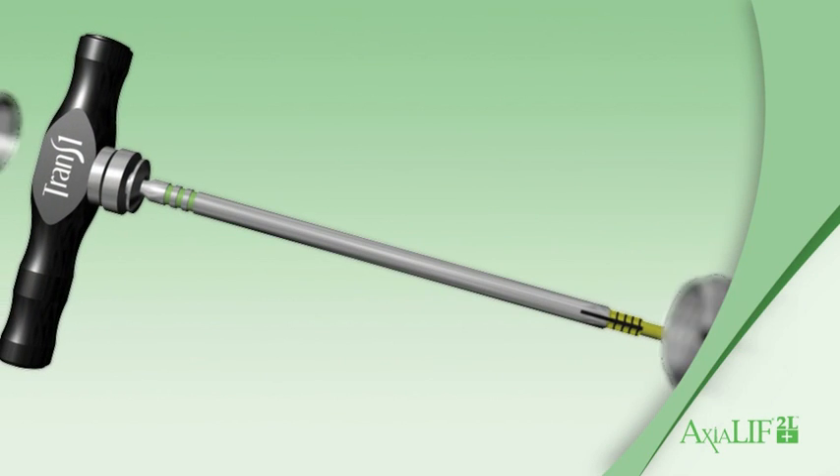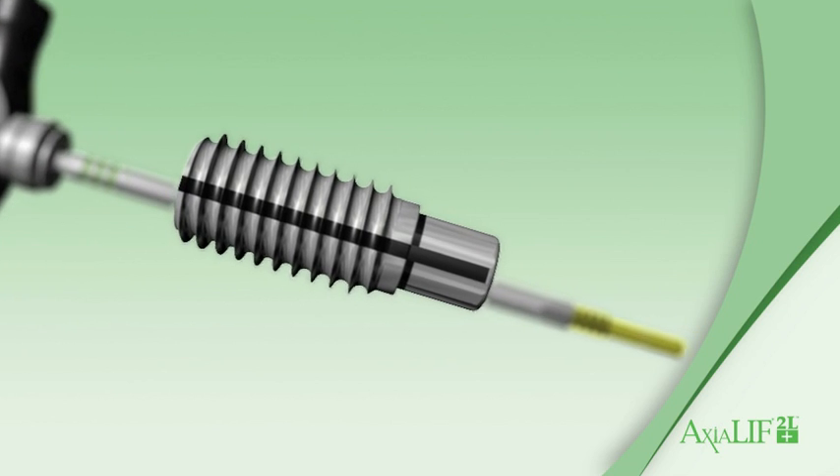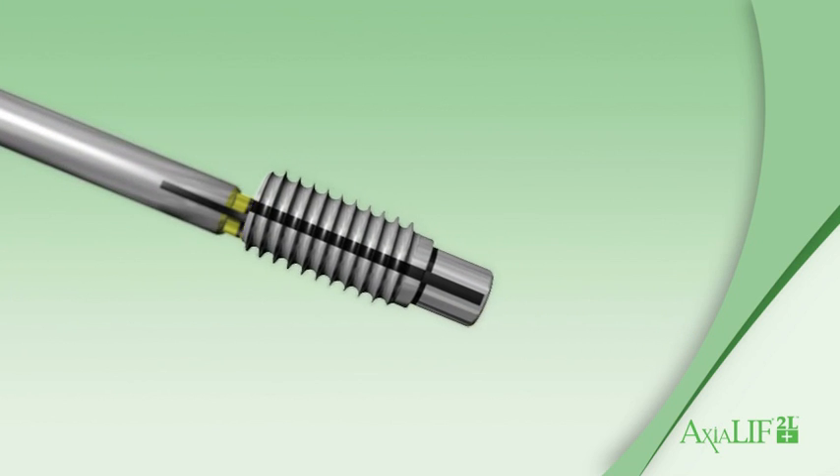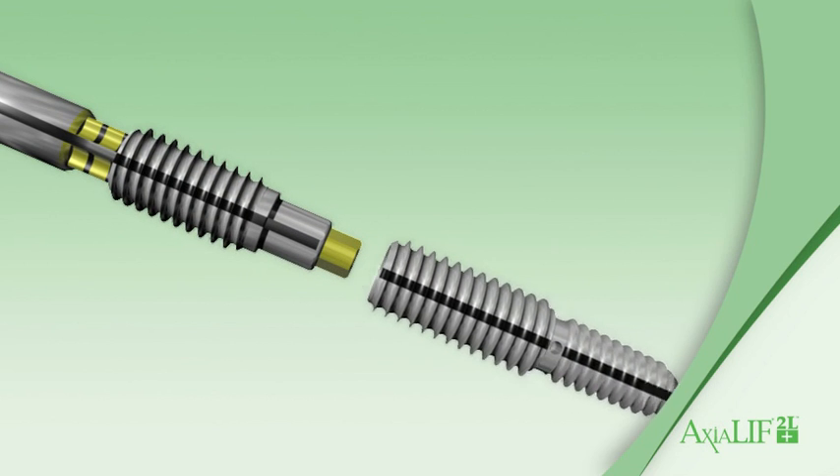Assemble the selected L4-L5 rod, distraction rod, and S1 anchor onto the dual driver and insert into the prepared channel simultaneously.